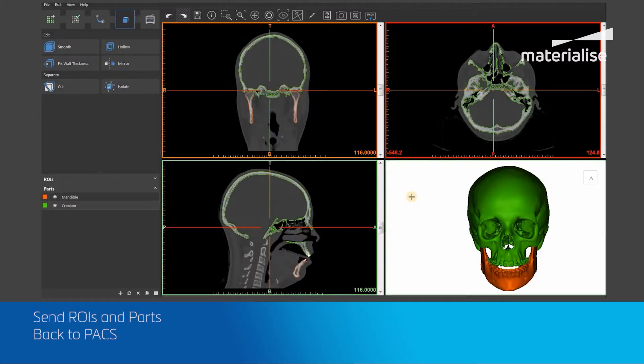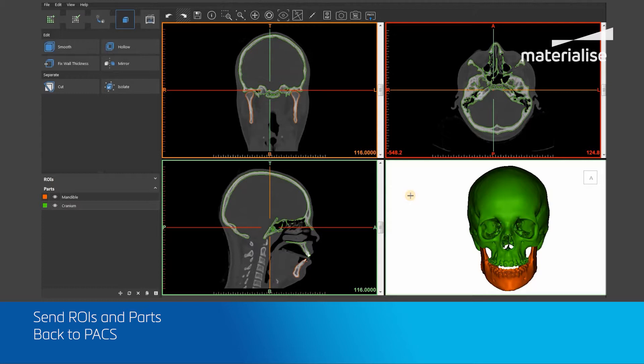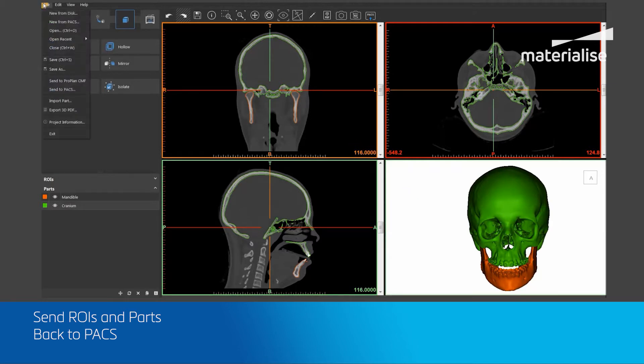Once you have exported ROIs or parts using Export 3D or Export 360 Degree Views, you can then send these DICOM files back to PACS. To do this, I will go to File and select the Send to PACS tool.